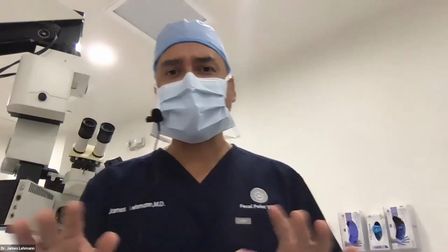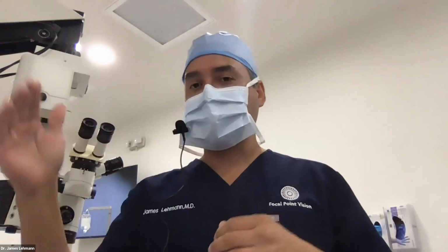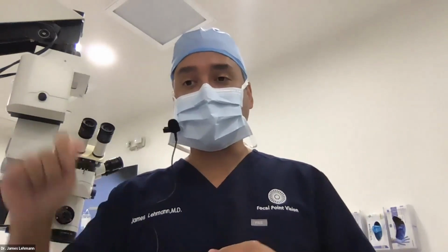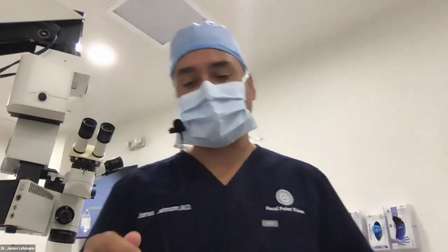So that's number 1. Number 2, IOL calculations can be hard in a very myopic eye, especially if they have steep Ks. Fortunately, lens powers in the myopes are generally very low, so the effective lens position isn't as critical as in a hyperopic eye. But those are the 2 main points. Also, sealing the incision. You're more likely to have to suture a wound on a patient with a myopic eye, because they have a thin sclera and a floppy cornea.